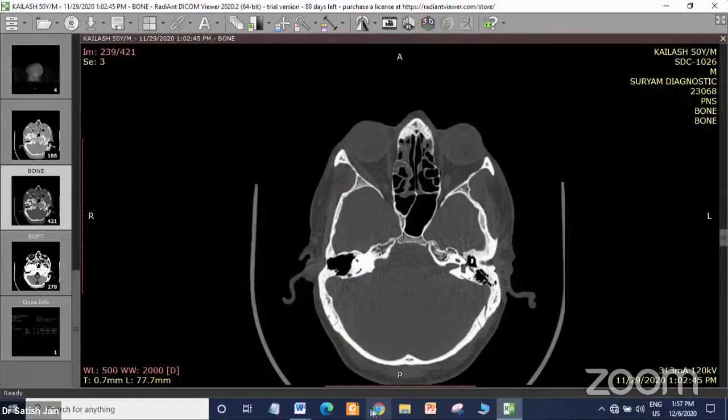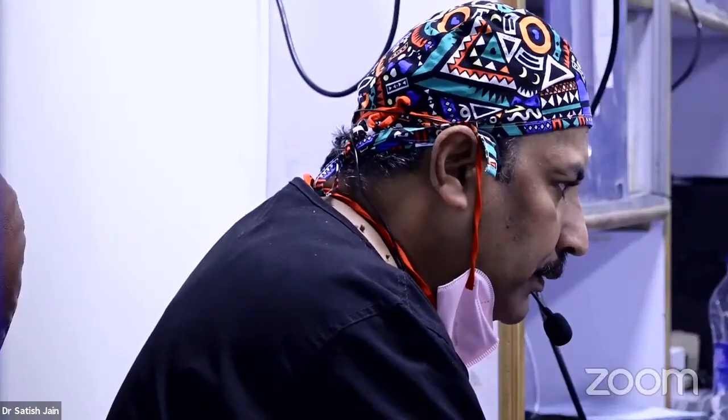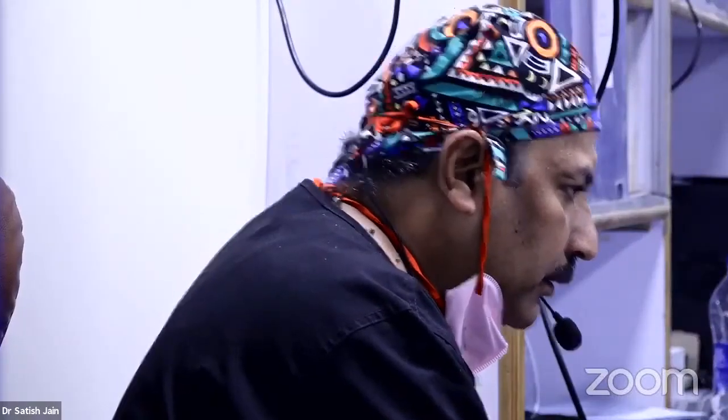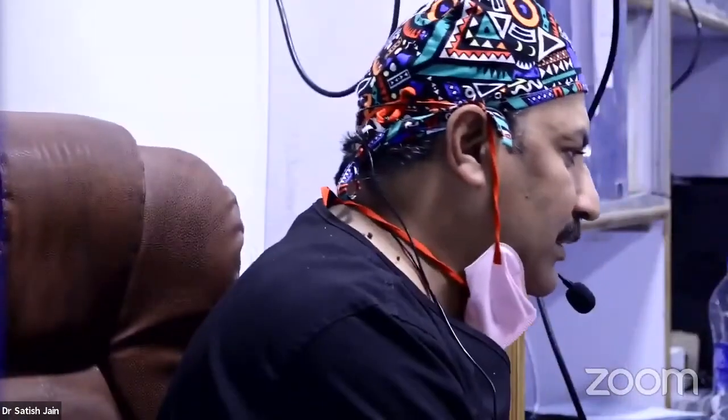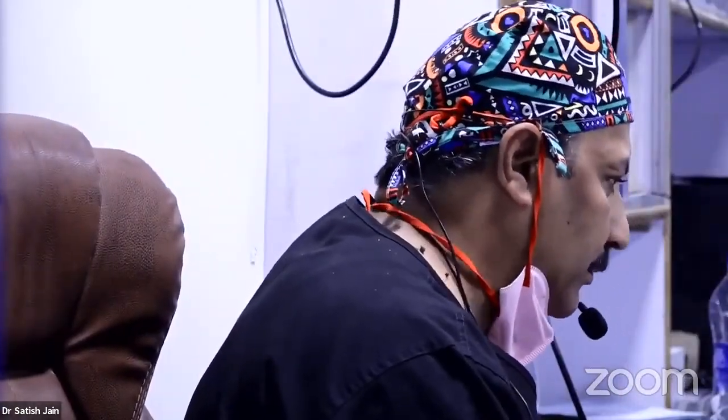Satish, there is a question. Yes, sir, please. In the full house FESS, if disease is to one side, should you do it bilaterally or that side only? No, no, on the side of the disease. Why go bilaterally once there is no disease at all?